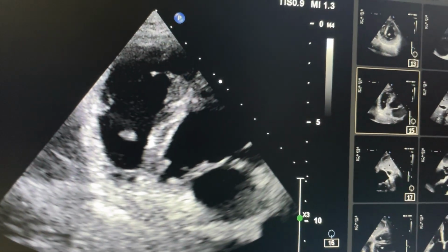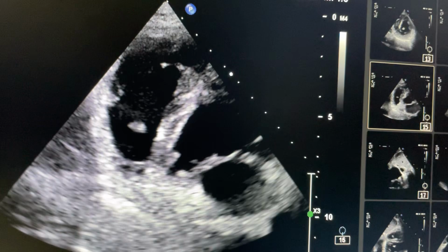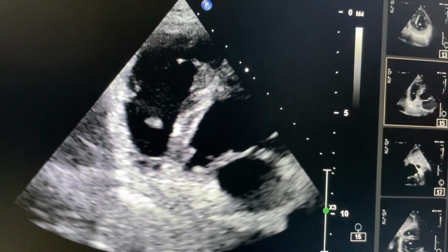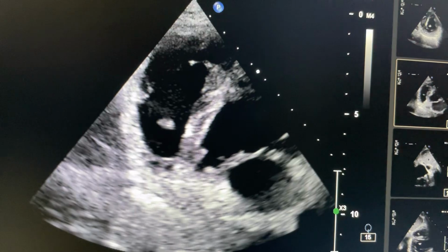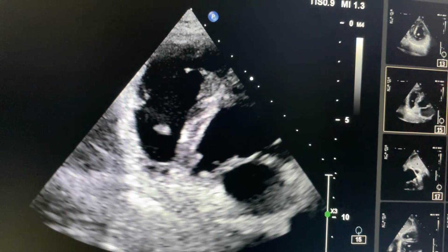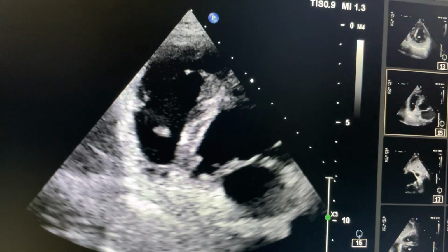This is an interesting case of coronary artery disease with right ventricle infarction, where the inferior wall infarction is very minimal, so easily missed. But the patient has a history of chest pain. At the same time, the troponin test was also positive. So the results showed the right ventricular infarction along with a very small portion of inferior wall infarction.